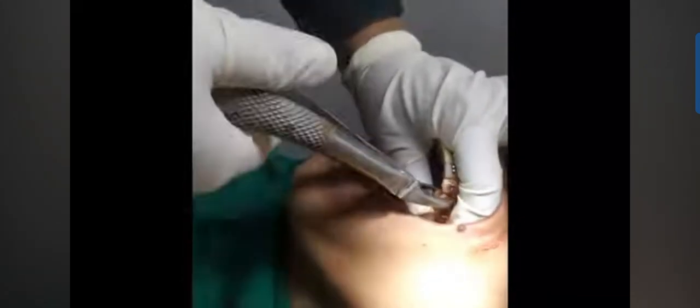Now take a maxillary premolar forceps and insert it in the apical direction firstly. The apical direction is the first movement for any tooth, and you should always remember that the forceps should be placed on the root and not on the crown. Now give bucco-palatal movements, buccally and palatally, and the last movement is the apical movement. So first and last movement is apical movement for any tooth, and in this premolar we have bucco-palatal movements along with first and last apical movement, and we have pulled out the tooth.